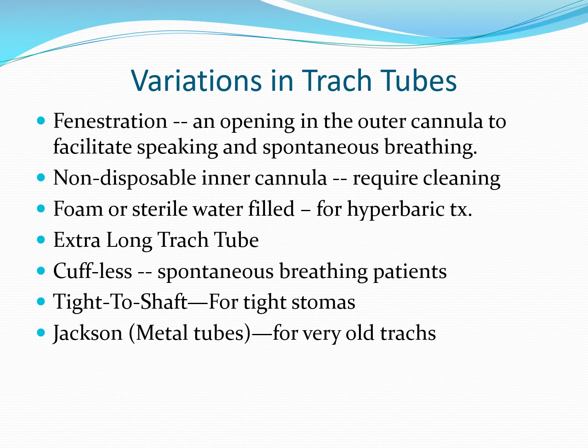So many of us have this assertion, if it's cuffed, that cuff is filled with air. It often is, but not 100% of the time. So you can have, Bivona makes air filled, but they also make foam and sterile water filled. One of the indications would be if a patient with a tracheostomy tube, particularly one who's on mechanical ventilation, is going for hyperbaric therapy.